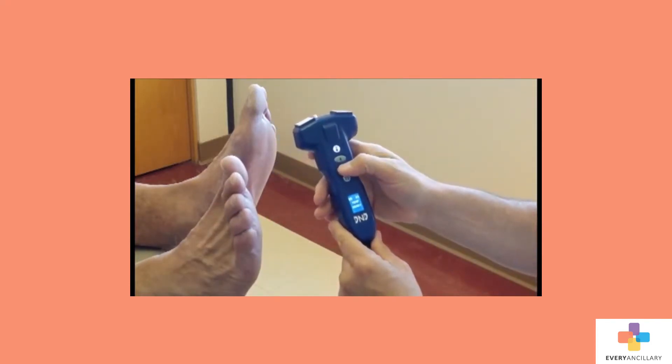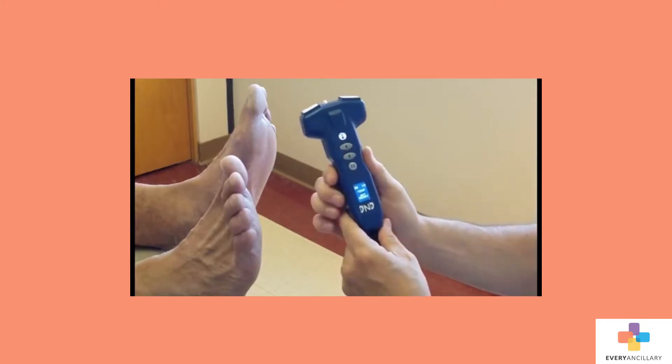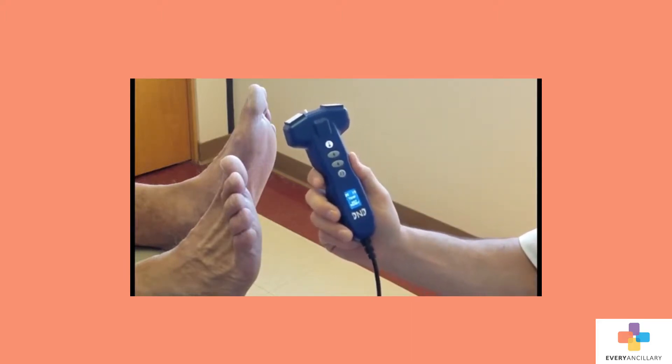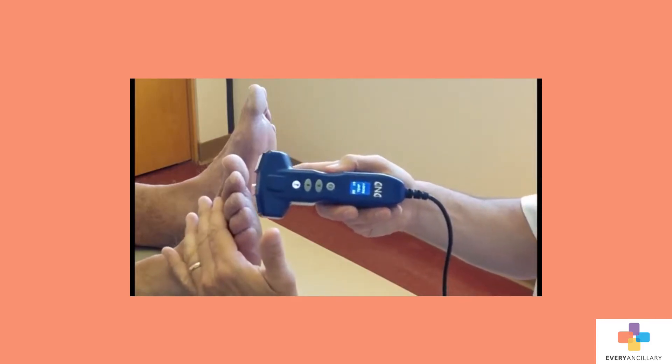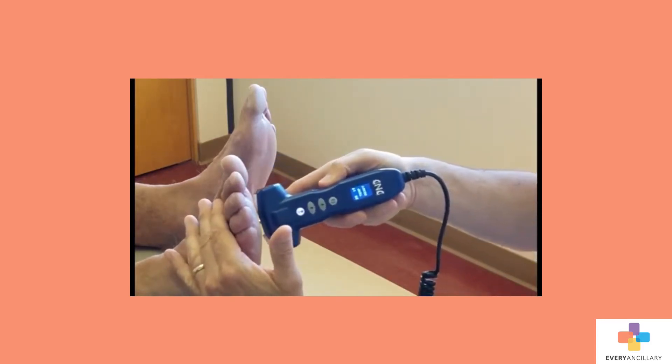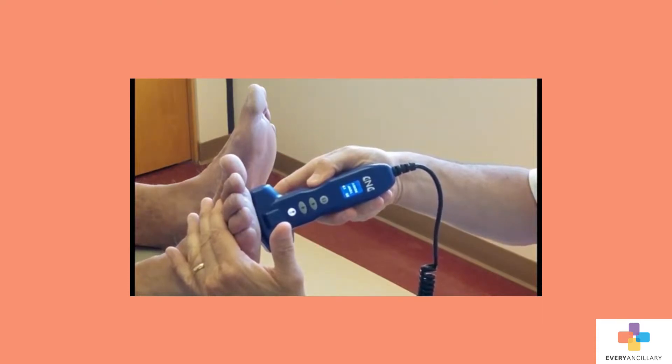Okay, we're going to test for a 6 degree temperature difference now. Can you feel the difference between these two pads? Yes, I can.